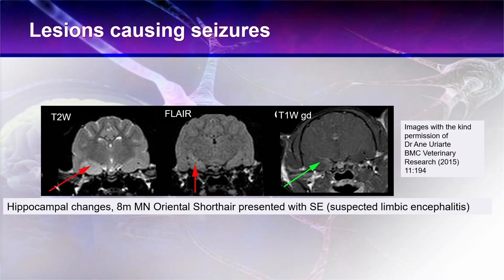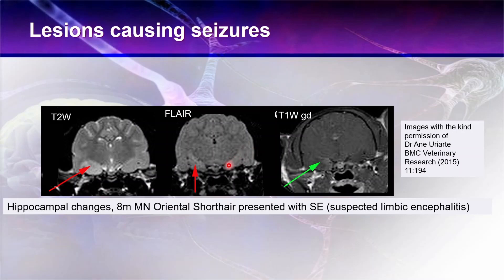Here we have another example. I have to thank Anna for allowing me to use these images. This is a cat that she originally saw with suspected limbic encephalitis. There are hippocampal changes in this cat. On the T2-weighted images, we have a swelling of the mesial temporal lobe. We can also see that change on the FLAIR, and we can also see contrast uptake. With limbic encephalitis, we will often have bilateral changes, and there's a suspicion of some edema on the other side, but it's not clearly realized here.